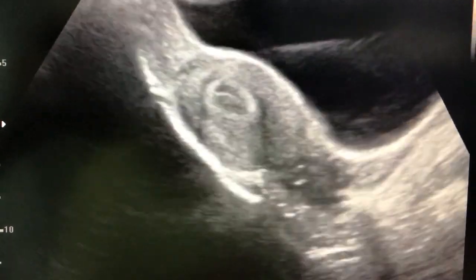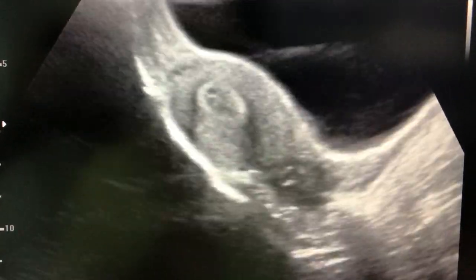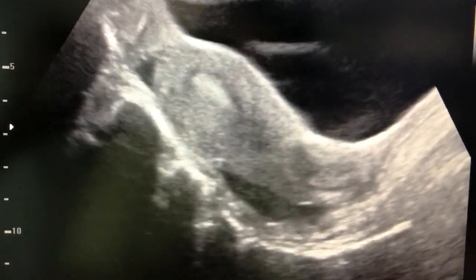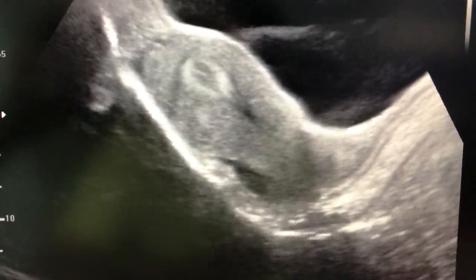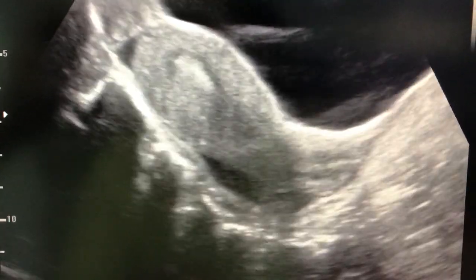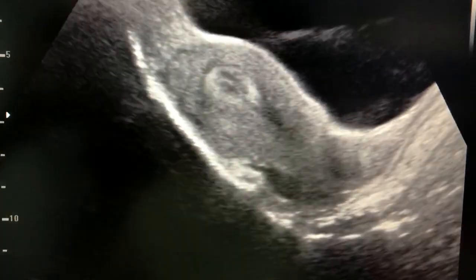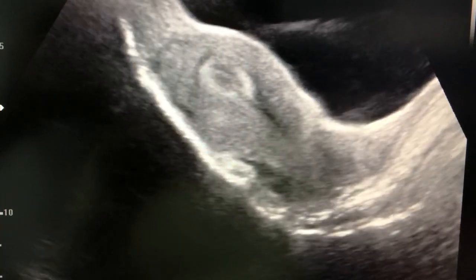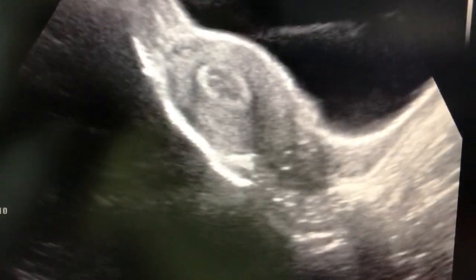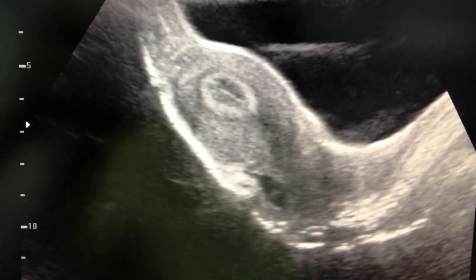25 years female, and this is a case of secondary infertility. Here you can see mild free fluid in the pouch of Douglas. This is the 13th day today; the LMP date is 28th June, so today is day 13.